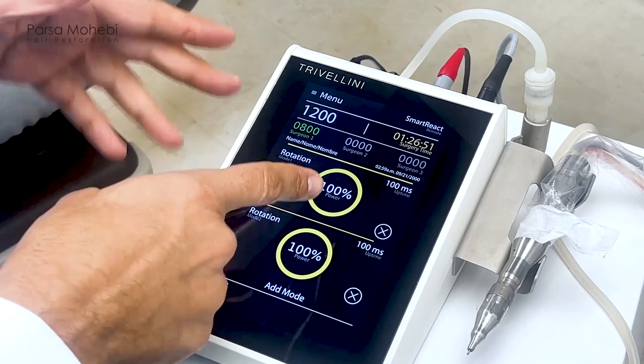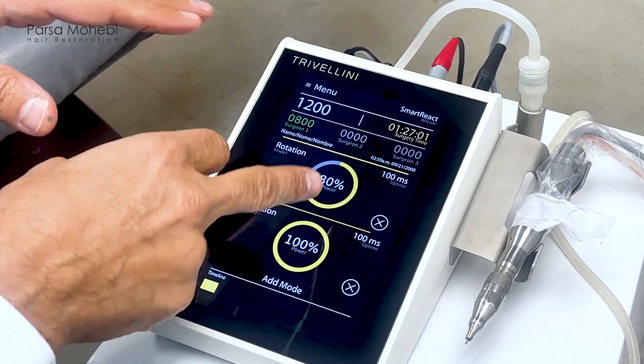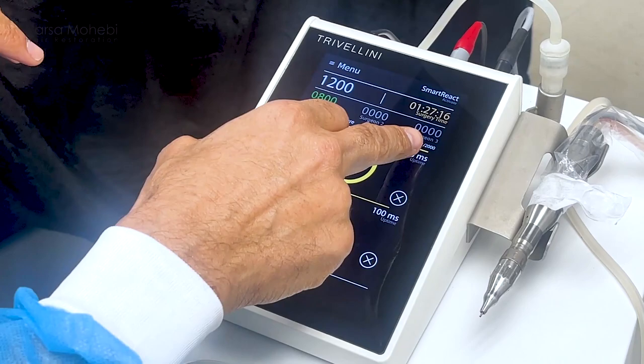The best setting is rotation at 100% power. This power can be adjusted — if you have fragile skin, we can go to 80% or even less. But I like to use 100% because there's not much of a problem cutting through the skin with 100% for the first millimeter. In that first millimeter, there's minimal chance of transecting anything. Use maximum power, and you can also adjust the time — I use 200 milliseconds for the first phase.